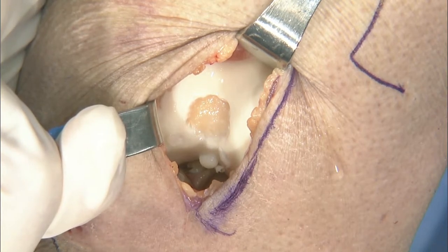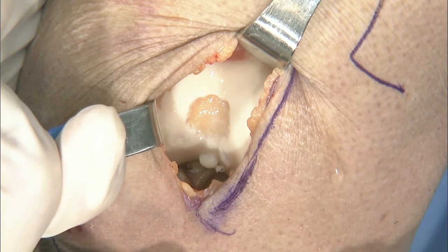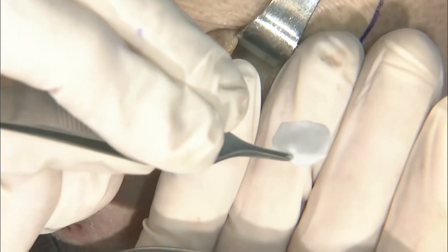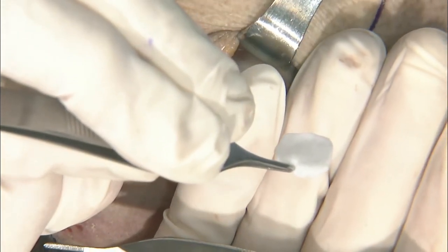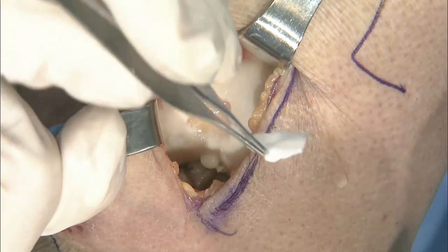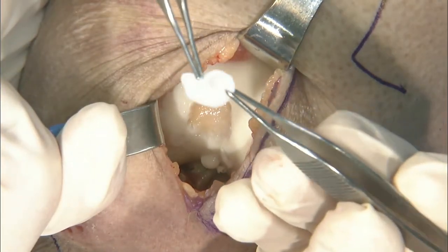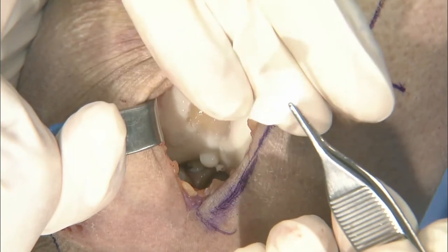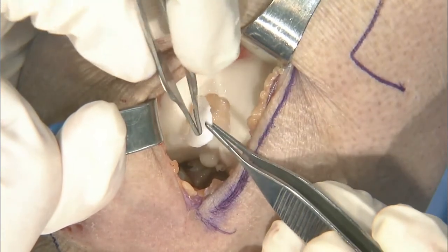Again, remembering what side is what. You can leave it on the knee, Lee. So I wouldn't always do this, but what I'm showing here is the implant itself. And again, I'm telling everyone around me, cells are up, cells are up. And then basically it's flipped over. And you probably can't see on the screen there, it's not really coming up, but that side is a lot smoother.